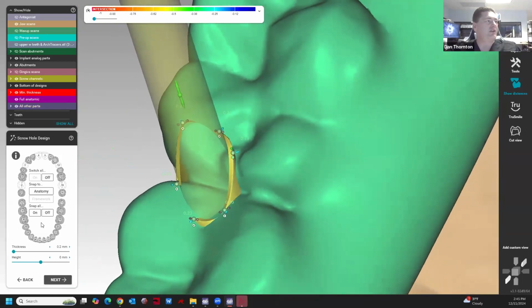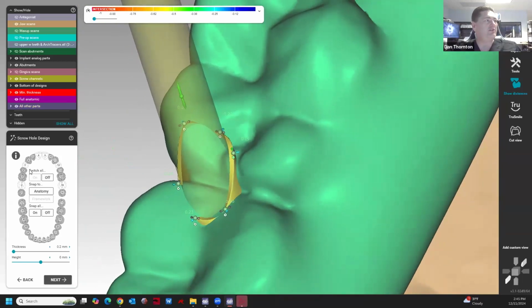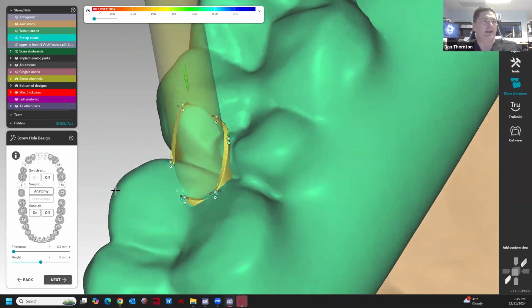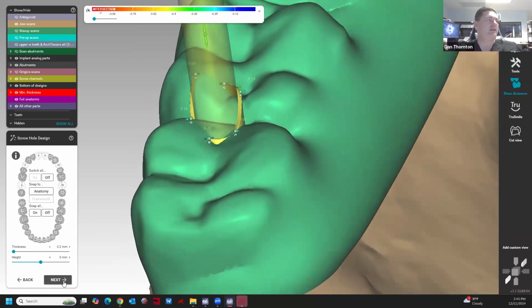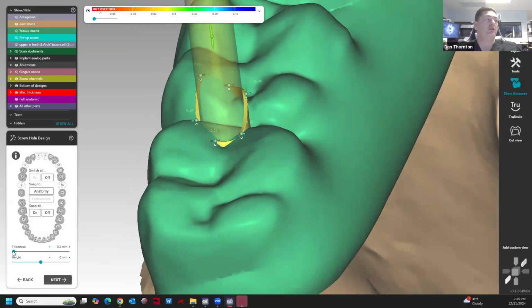The funnest thing is going in and playing with all your little CAD features. And I know a lot of us technicians get a streamline of what we want to do, and we never play with anything else unless we accidentally hit it one day, or we see a webinar, or we're talking to somebody and they're like, oh yeah, have you tried this? And then we're like, oh, okay.